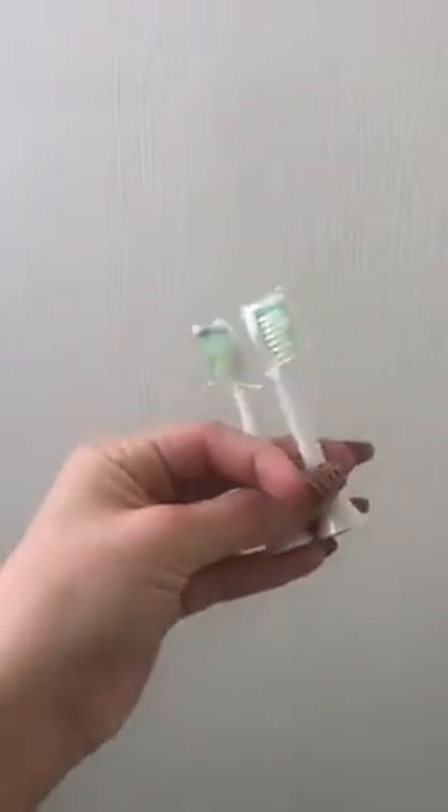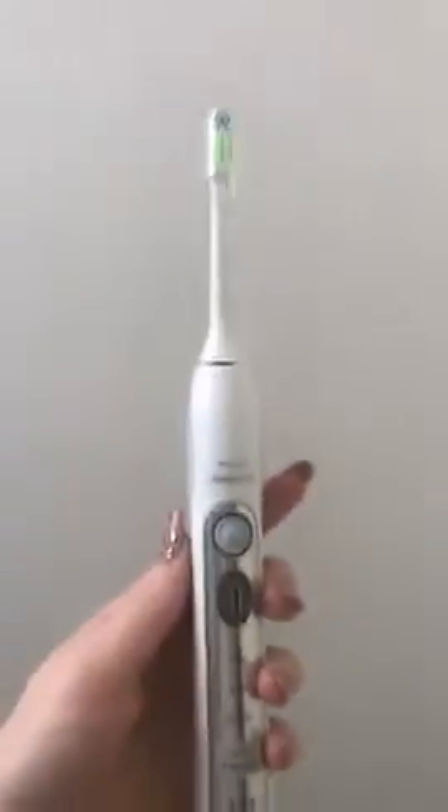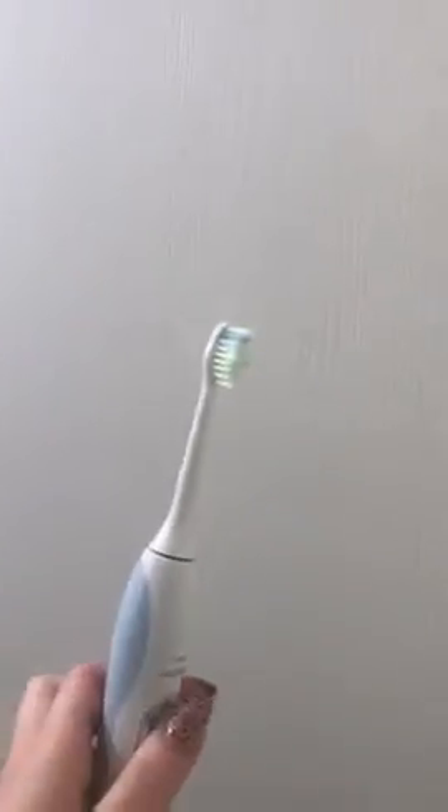I went ahead and opened this — it was the eight pack — so I just opened two of them. The first toothbrush is going to be my Sonicare, so let me just see if I can pop this on. It should fit nicely, which it does. I just take the cap off and it doesn't seem to be loose or anything, so that's a good fit.